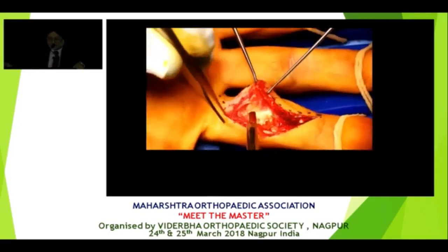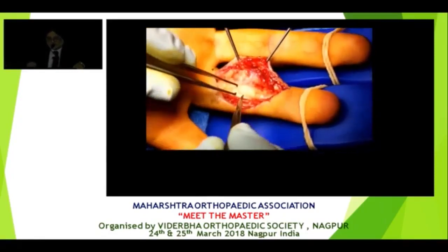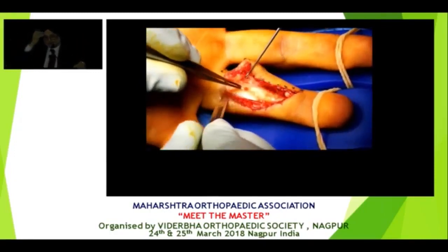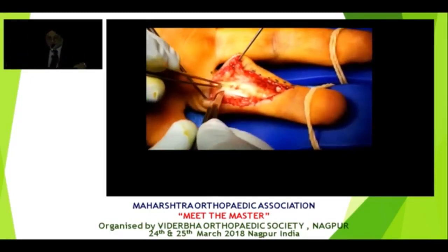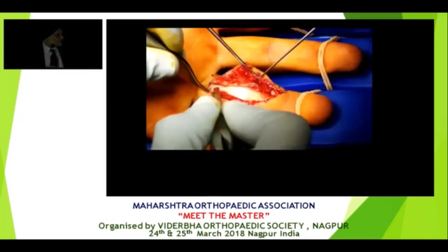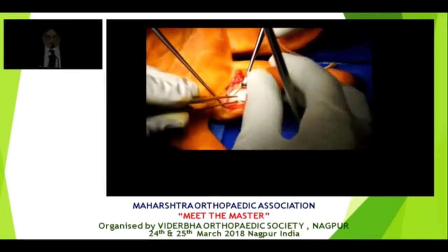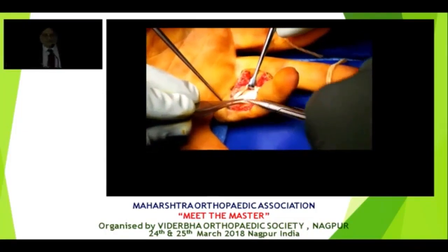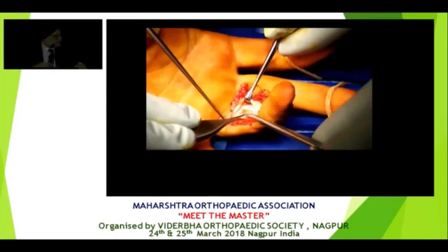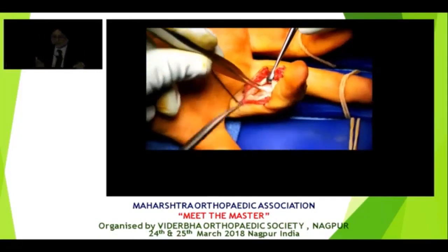So we do a volar Brunner approach. Now in this case, we can open the flexor sheath because we are opening between A2 and A4. So you leave A2 and A4 intact, so you won't get bowstringing. So here we're elevating the flexor sheath. Okay. So now we're going to retract the FDP to one side, okay? Now the FDS already has a natural split, so we make the split deeper. So if you make the split deeper down, you can now move one slip of FDS to one side and one to the other side.